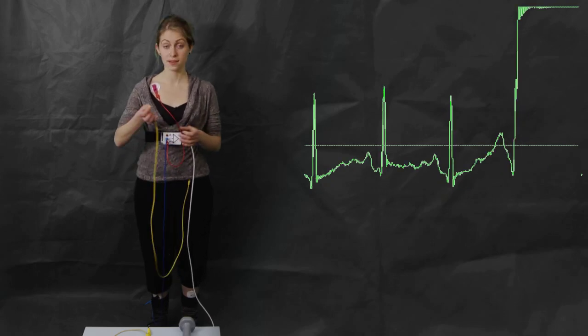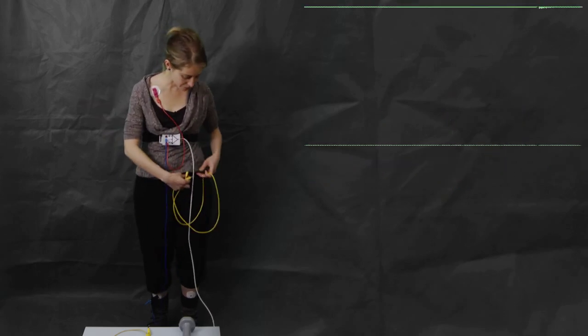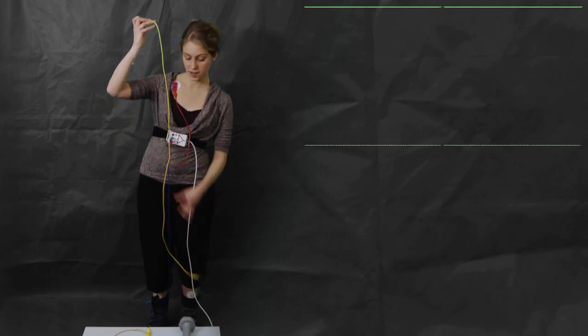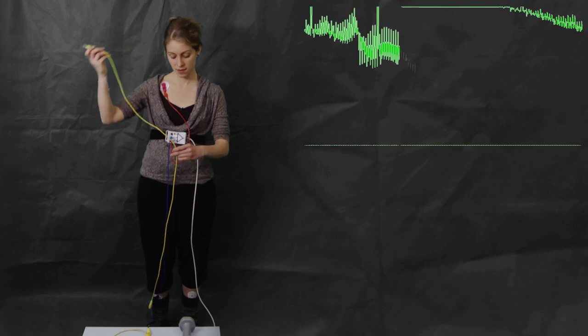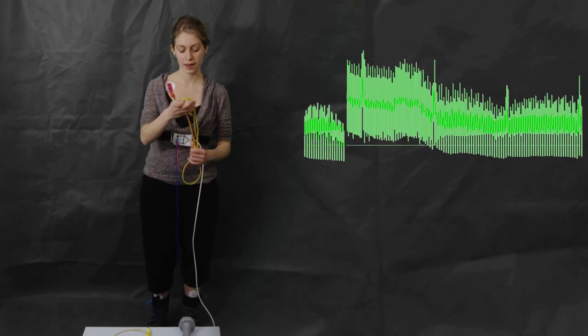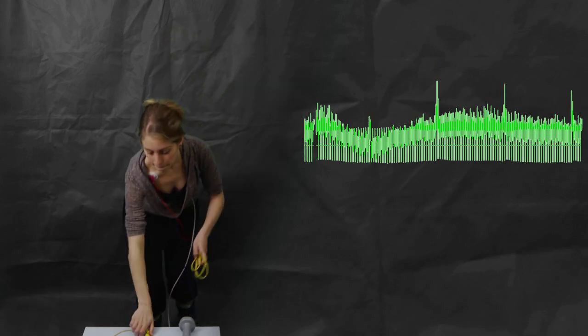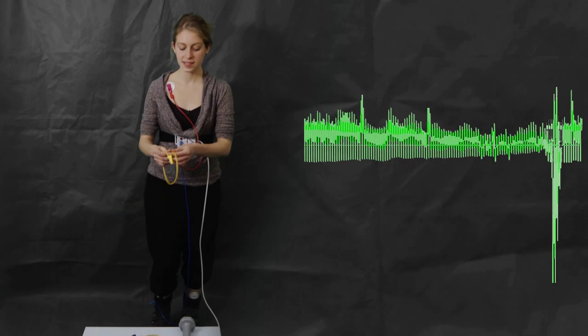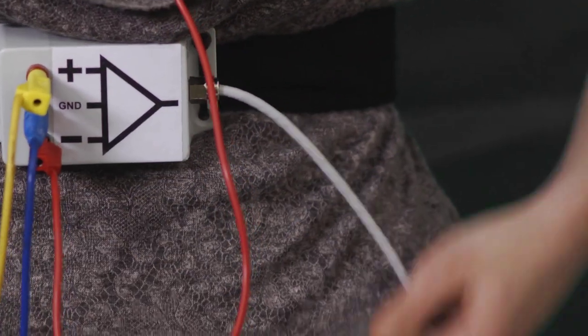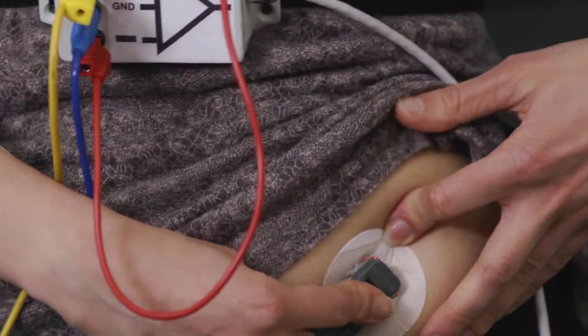So I will disconnect this really long one. You can see here how long this cable is, and the chances of it affecting our recording via its movement are pretty high. And instead I will replace it with this really short one. And get a nice recording without any excessive movement.